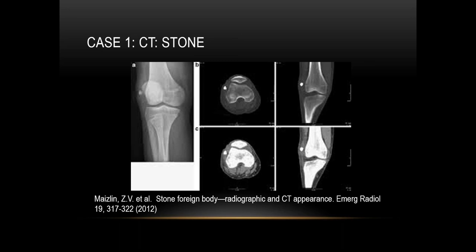Here is an example of CT: a patient had a stone foreign body. The x-ray shows a radiodense object in the subcutaneous tissues of the medial aspect of the knee, which can be readily seen on CT and localized in three dimensions.